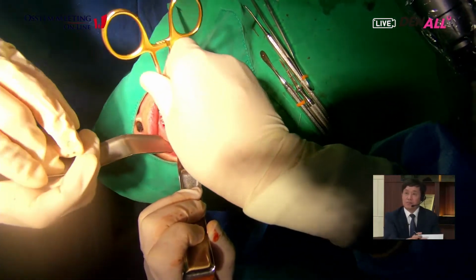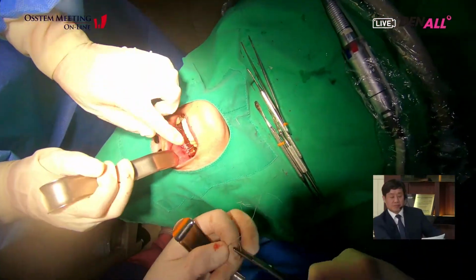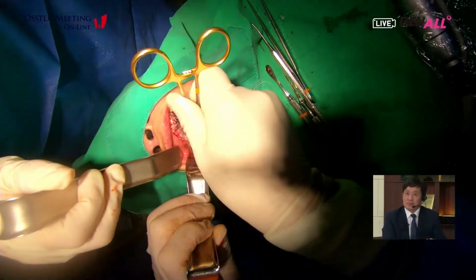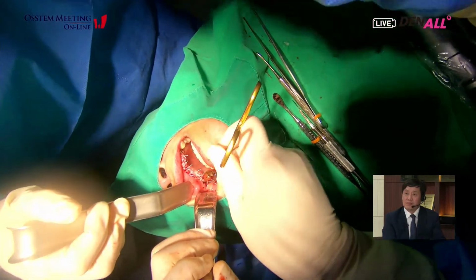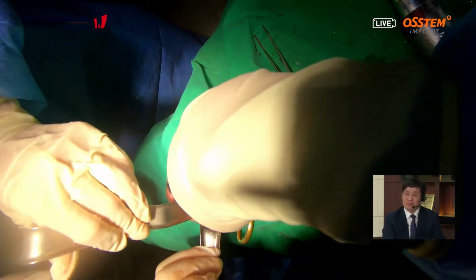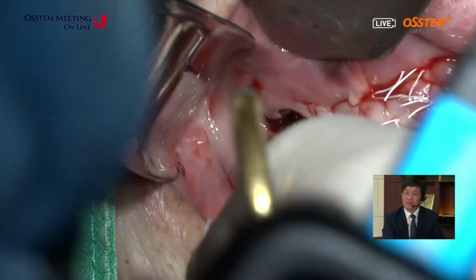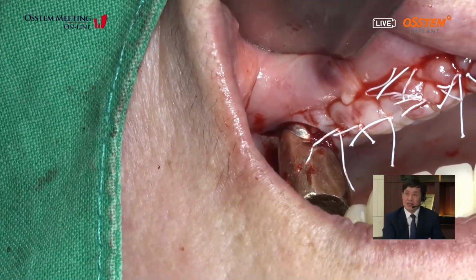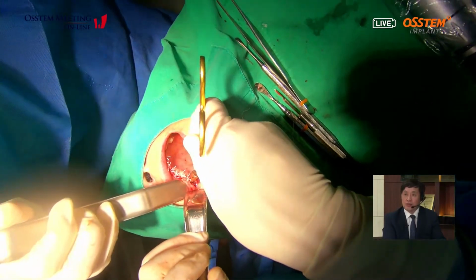Yeah, because of peri-implantitis around the pre-existing implant, the soft tissue quality is not so good. But this patient is quite an old patient, so I will do conservative therapy during waiting for healing. Yeah, he said the patient is an elderly patient, so for the preservation.